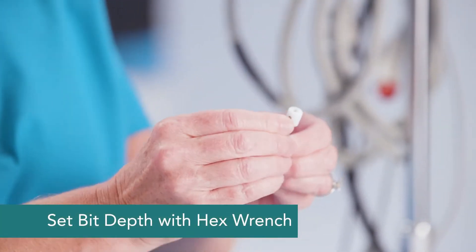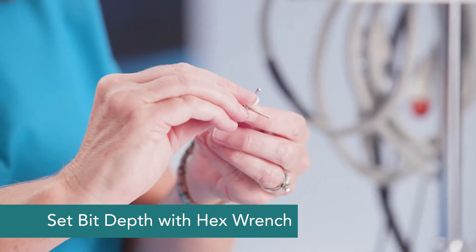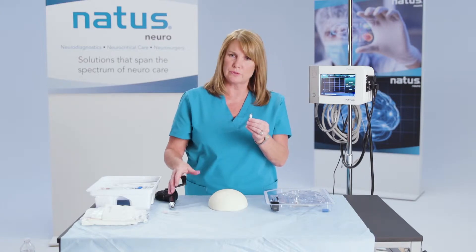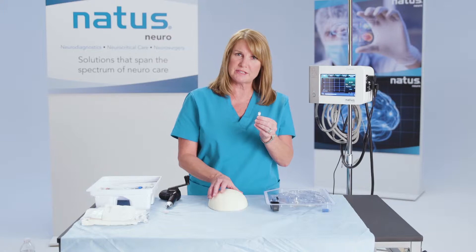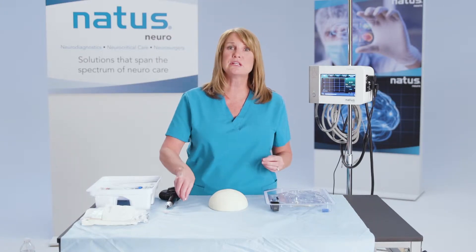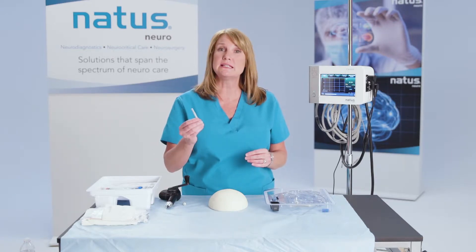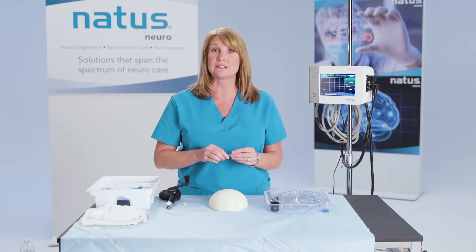We're going to set the depth of your skull. This would go into your hand drill, and for demonstration purposes, I've already created the hole through the skull cap here. The next thing you're going to need to do is open the dura, and that can simply be done with an 18 gauge needle or a spinal needle, whatever's convenient for you in your cranial access kit.